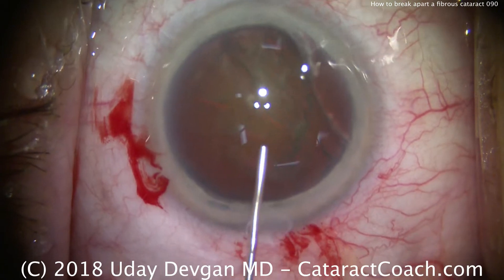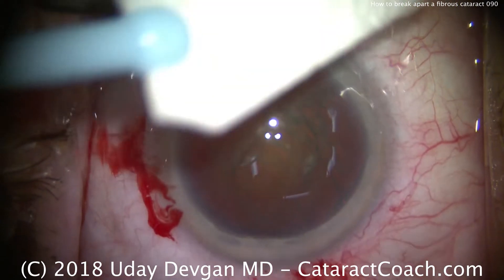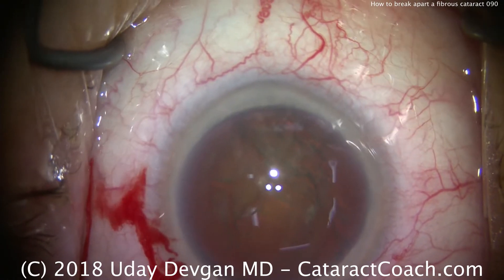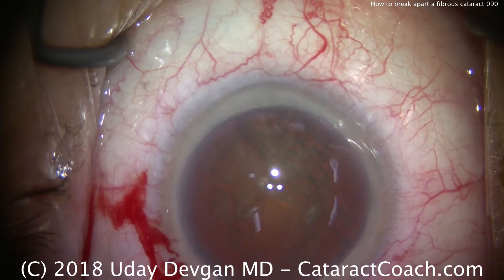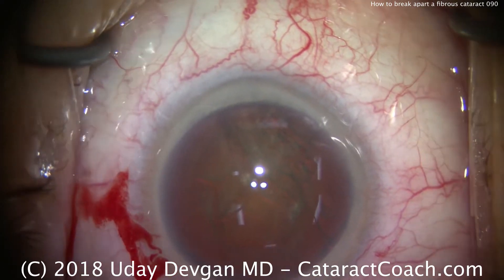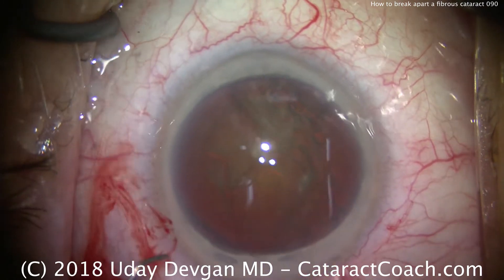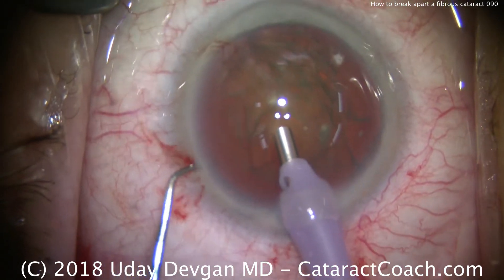A little extra amount of dispersive viscoelastic. Now just removing some mucus from the surface of the eye. For the chop settings here, we're going to use a high vacuum, high flow — 50 or 60 cc's a minute for flow, a vacuum of at least 500 millimeters of mercury, and a high infusion pressure or bottle height.